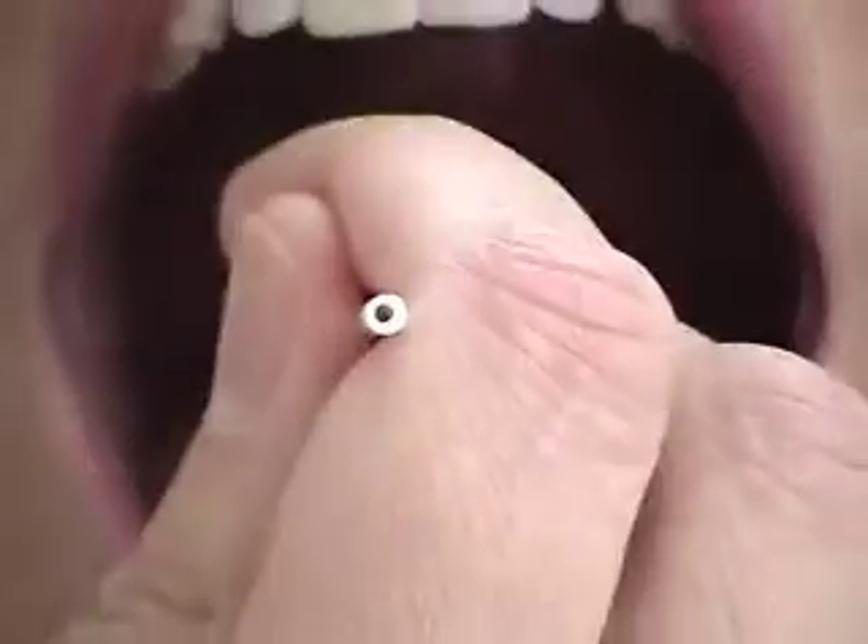So you go up, across the uvula, and down the other side — up the right pillar, across the uvula, and down the second.